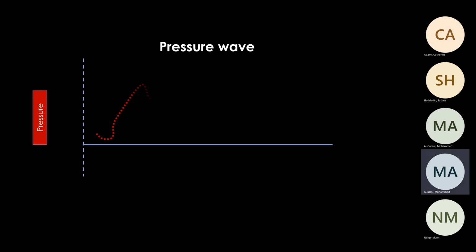All right, a quick review that will not take more than a few minutes. We divided our lecture into pressure, flow, and volume. We talked about the pressure, we talked about the flow, and we talked about the taxonomy, or the naming or tagging, of mechanical ventilation. For the pressure waveform, the pressure starts from the PEEP, which is the 0 for the patient, and goes straight to the peak. That's what we call the peak pressure, or P peak.